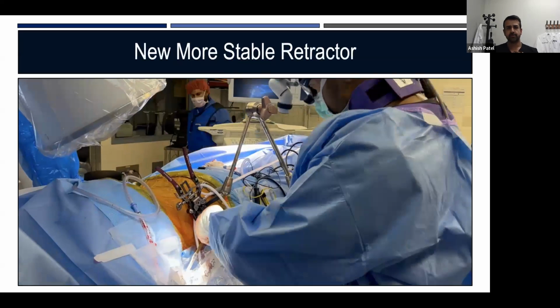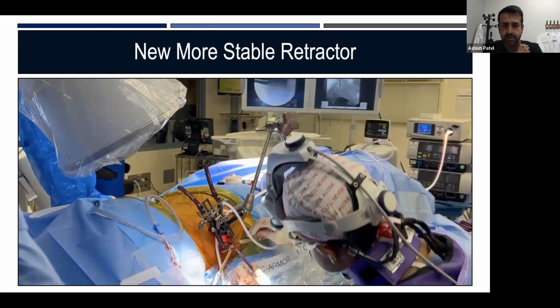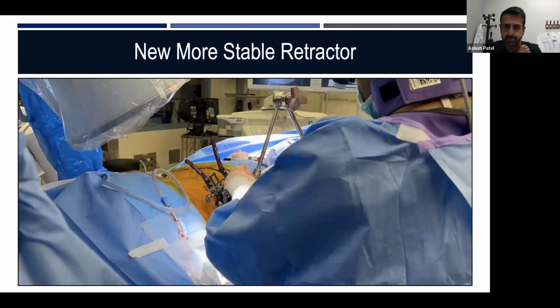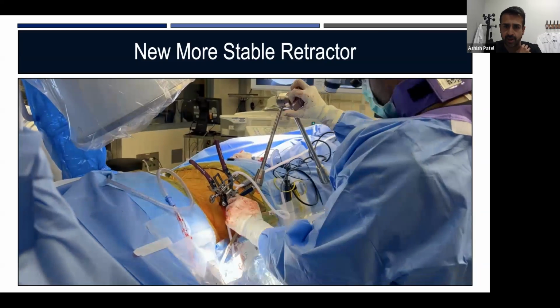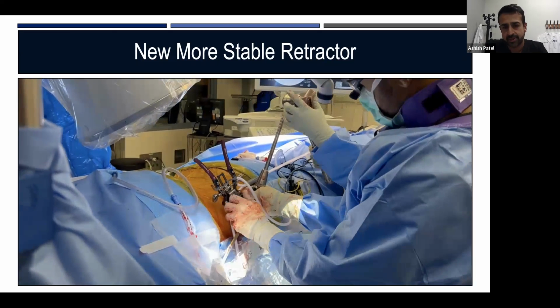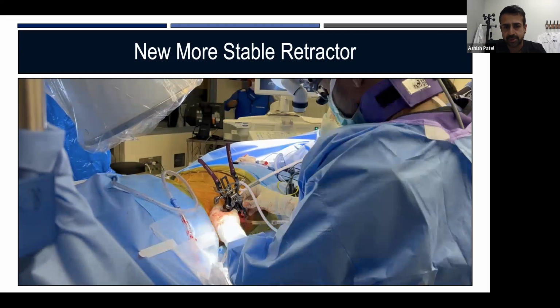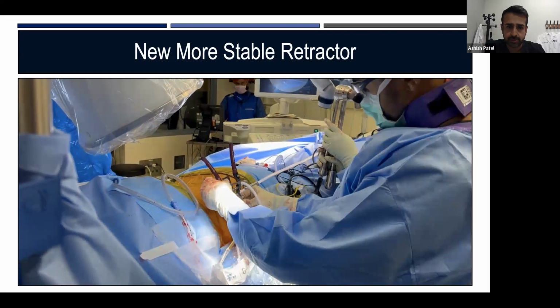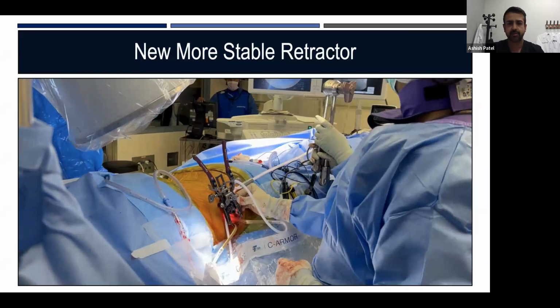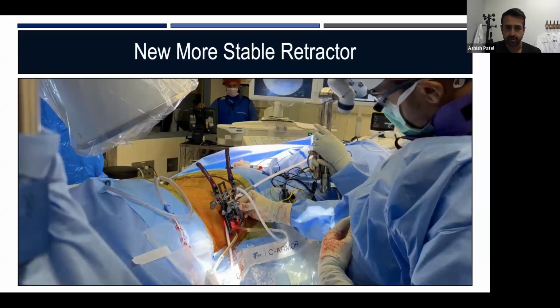In this video, you can see that the bed is slightly rotated. I've placed my implant into L4-5. I'm taking out my ALL retractor. I'm undoing the articulating arm, which I have for stability as well. And as I loosen these things, I have that screw shim in the posterior blade. What I'm demonstrating is how stable the retractor is to the spine with just the screw shim alone. And that's the type of stability that we need, so that we can improve the reproducibility of this technique.